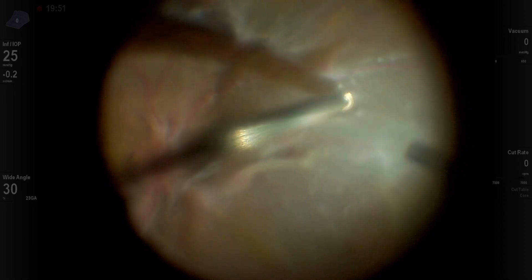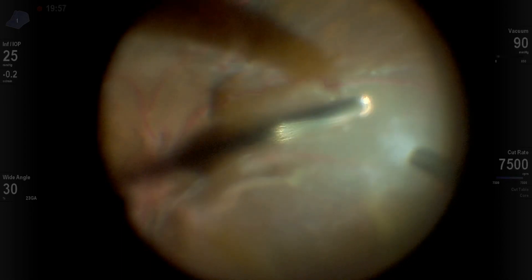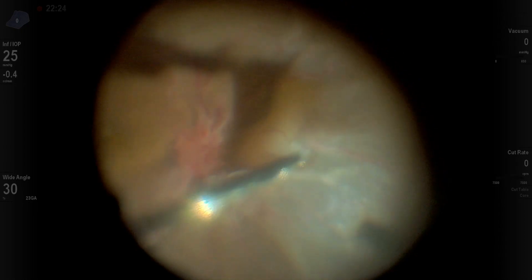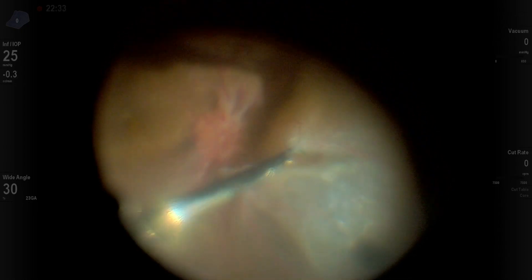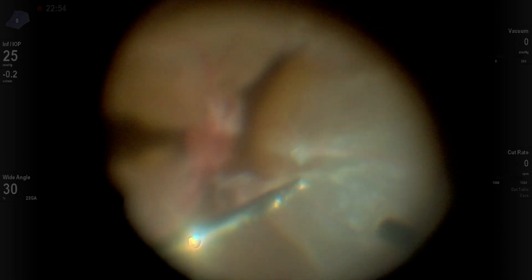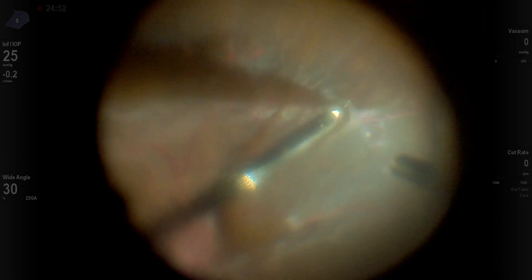What I've been trying to do in this case is to use instruments efficiently — for example the vitrector — then switch to other instruments such as the vertical scissor to cut the adhesions and go outside to the periphery, then switch to the horizontal scissor. So I've been trying to be efficient with the use of instruments, though it still took a long time. This is the vertical scissor, and you can see the scissors do not cut vitreous very well. That's 23 gauge.